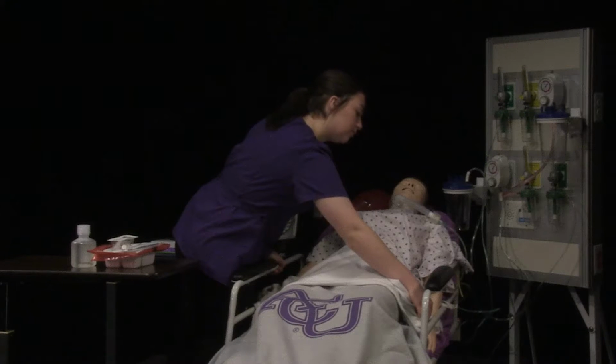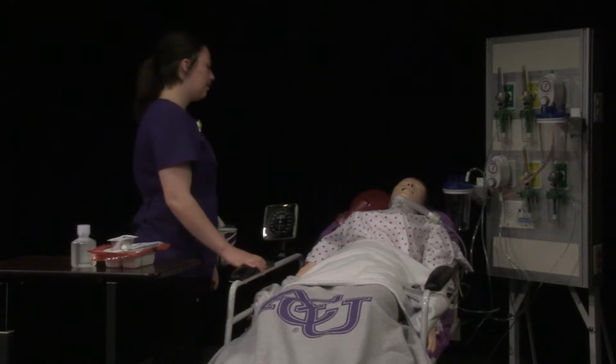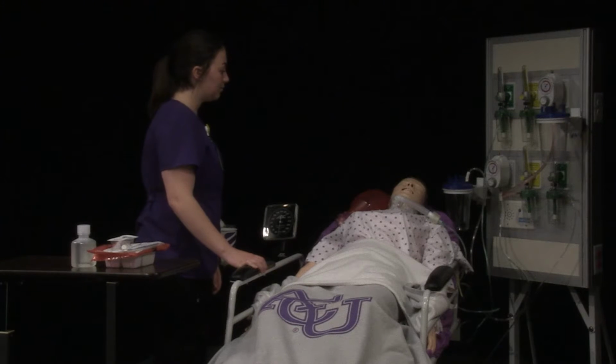And explain the procedure to the patient. So I'm going to be performing some tracheostomy care today. So what that means is I'm going to remove the old dressing and the old inner cannula, put on a new dressing after I clean the area, and then I'll also put in a new inner cannula and a new tracheostomy collar. Do you have any questions about that?